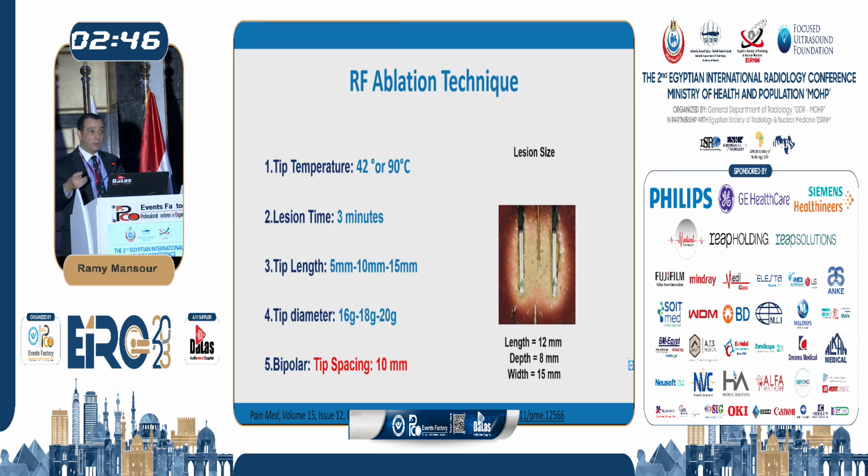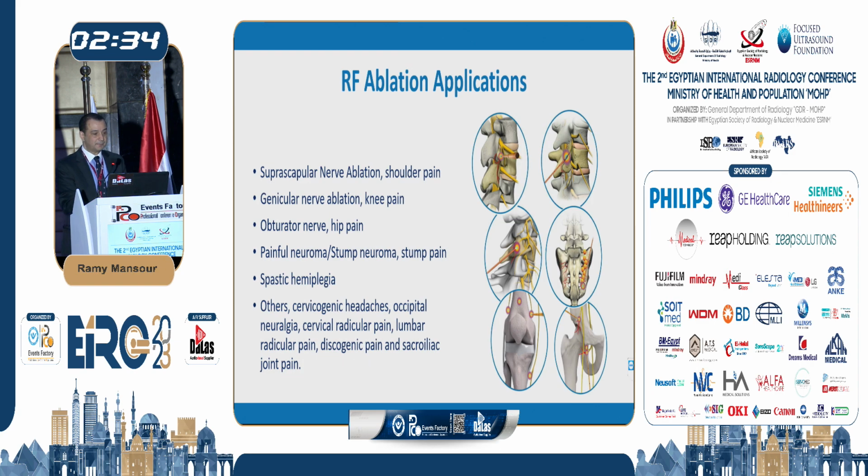So that's why it's important. I personally think increasing the size and using bipolar is better than putting the patient on for 6 or 12 minutes. And this is the reason, this is the physics behind it. So we now know the basics.